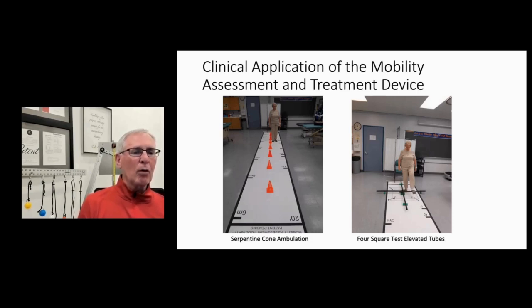And once you have a little competition there, especially with the time of the watch, you go ahead and have the person go through. And this repeats the turns to the left and the turns to the right. We can do this then using cuff weights, or we can use a weighted vest to make this even more challenging and work on some strength building with the patient.